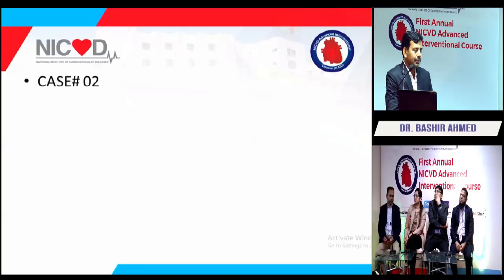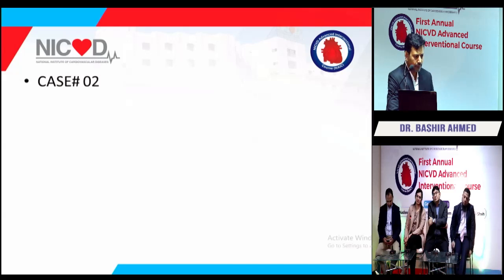Moving to another case. Today, the first patient was an 85-year-young male, and the second patient is also an 85-year-young male, with a status of failed PCI about 8 to 10 months back. He presented with non-ST elevation and was taken for early PCI.